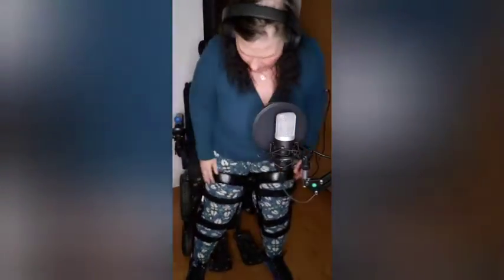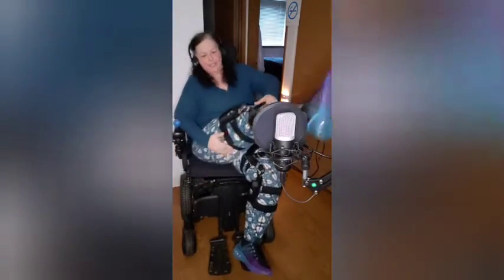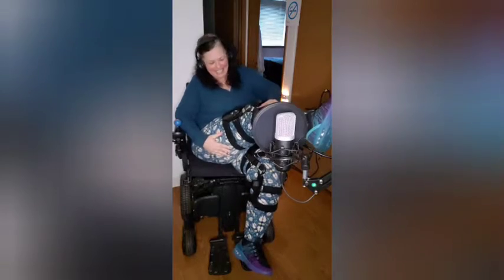These are KAFOs. These are knee, ankle, foot orthosis. And this is what they look like. It's my leg holding it up. But yeah, they're made out of carbon fiber, steel, and Velcro straps. Don't forget the Velcro straps.